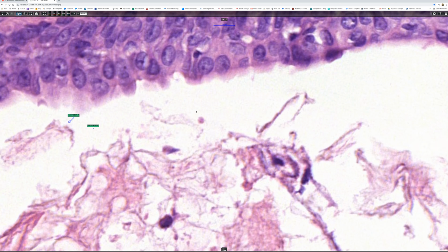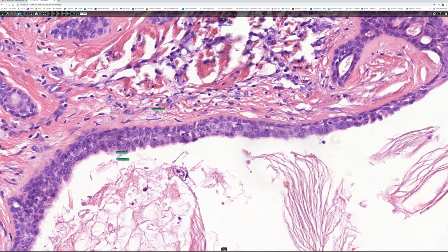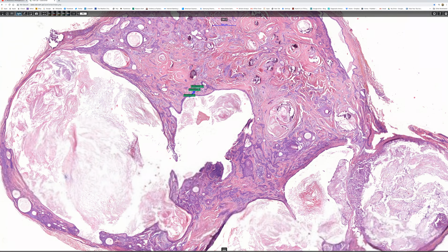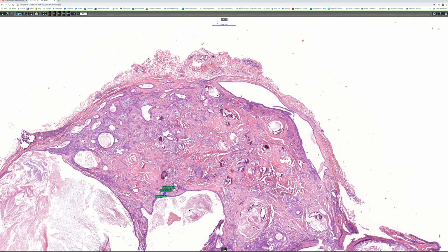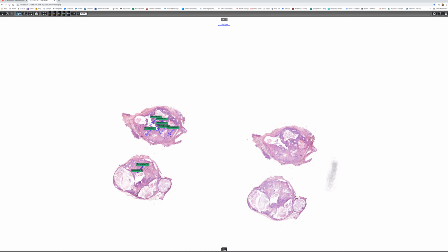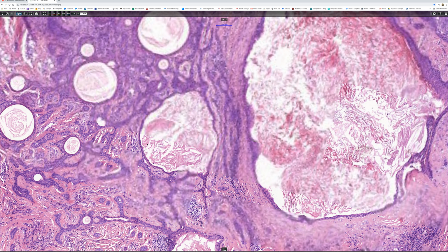So that's in this example. Now Antonina, I think, has been annotating this as well, but I don't know what this refers to, so I'm afraid I can't comment on that. There is an additional feature which is really nice in this case. We'll go to a lower power. Yes, let's look at this one. This is quite special.